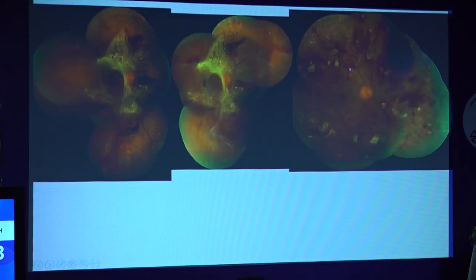You will see in the end and in the post-operative picture also, all these residual stumps of neovascular complexes, they are harmless. And if they are encroaching the posterior pole, Dr. Ajay would be speaking about it. An additional maneuver you can do is peel the ILM so that when they regress further, they will not exert traction on macula.